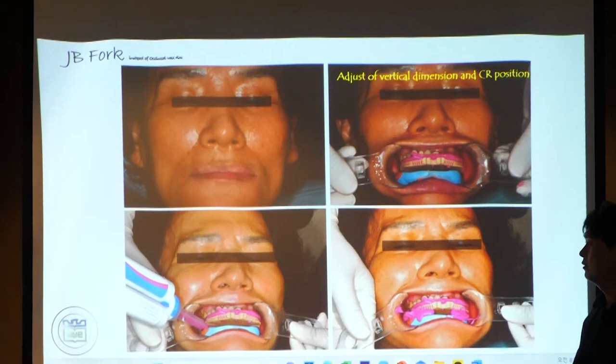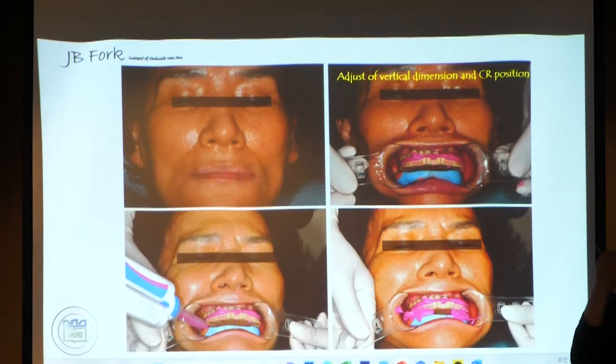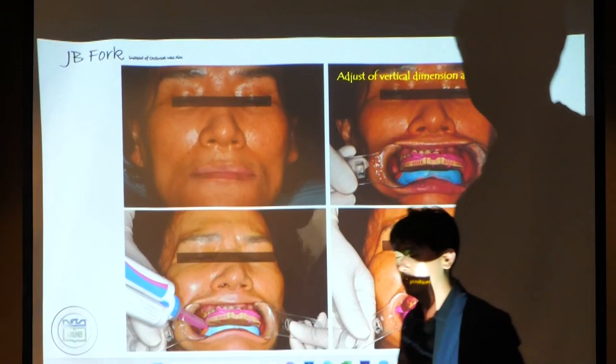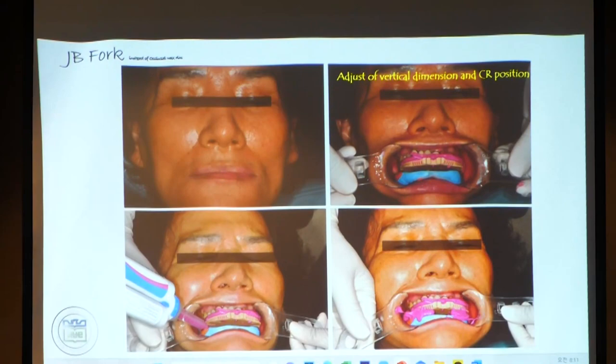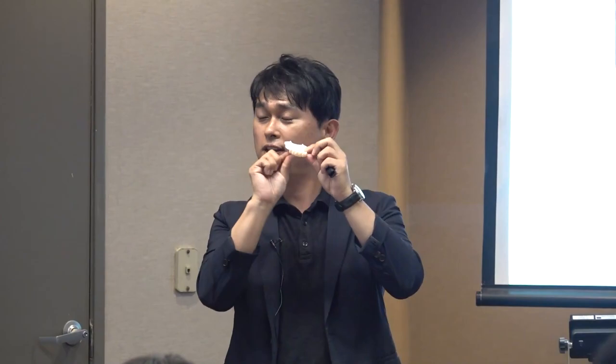If the patient has only lower whole teeth and has lost every tooth in the upper jaw, it's easier than the other case. First of all, the lower plate is not necessary. The patient has every lower tooth, you position the upper plate properly, and then you measure the vertical dimension with the Lucia jig or resin added in this part, and then bite. That's all.